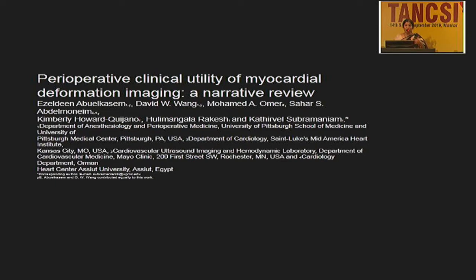So I am now becoming more confident in saying the LV is normal only when the global longitudinal strain is normal, because we all know that assessing the regional wall motion abnormality is very subjective, and it varies from one individual to another. And post-operatively, when they call us for having had any problem, it becomes difficult for us because we don't know what we saw previously. Although there is a comparison, we ourselves might go wrong. So the global longitudinal strain assessment gives a more objective assessment of the LV function, and it is highly recommended.